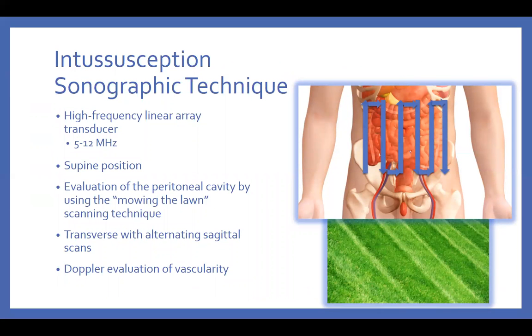So now we're talking about sonography. The question is, how do you perform the exam? What is the technique to do it? I know this could vary from place to place. I do believe that the people who do the ultrasound, the sonographers or the physicians, whoever is doing this exam, if we follow a certain systematic approach in performing this exam, it can make it easier for us. So this way we don't miss any intussusception in the abdomen or the pelvis.